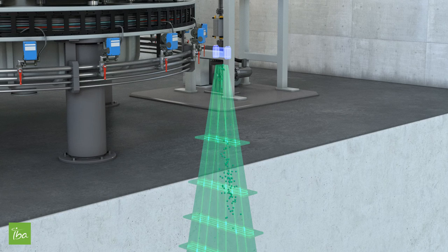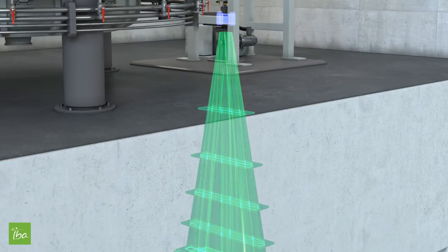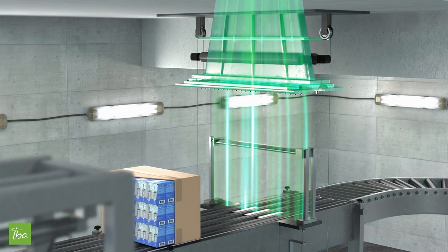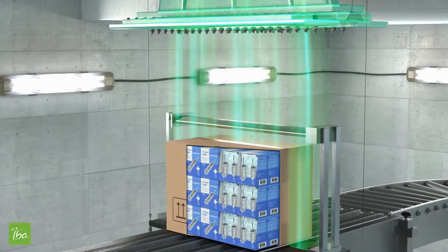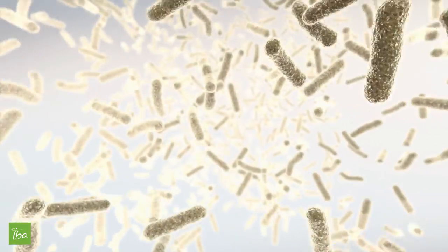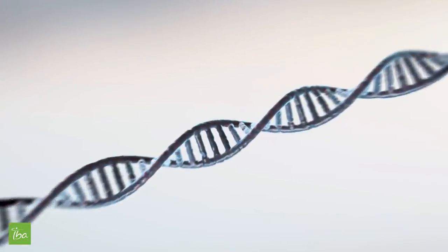The electron beam is then diverted in the scanning magnet to create a curtain of electrons going out of the scanning horn to irradiate the entire boxes of products. When passing under the beam, the boxes are irradiated and the DNA of the bacteria included in the products are damaged by the electrons, preventing them from reproducing themselves.